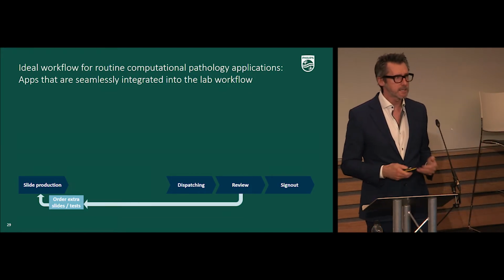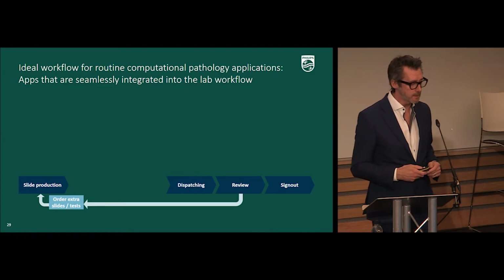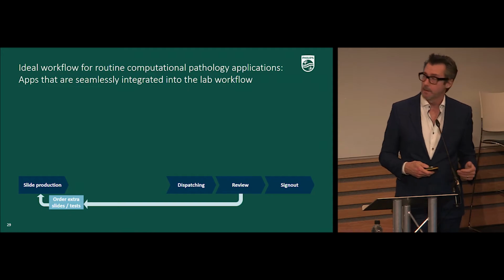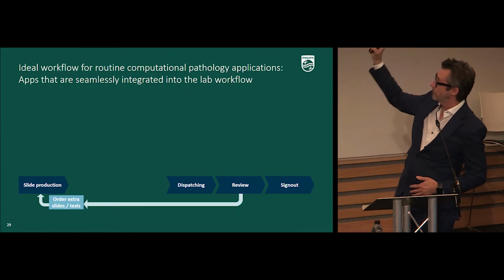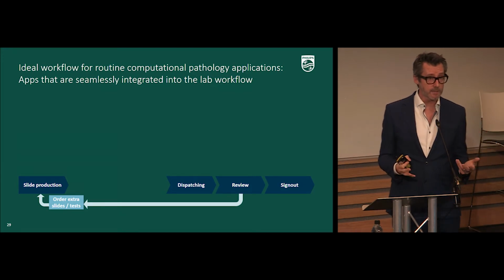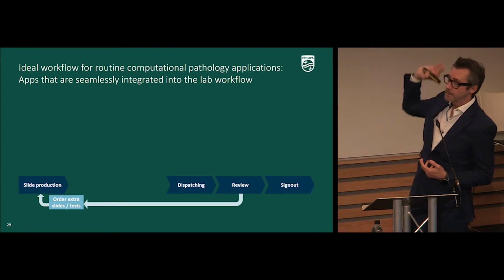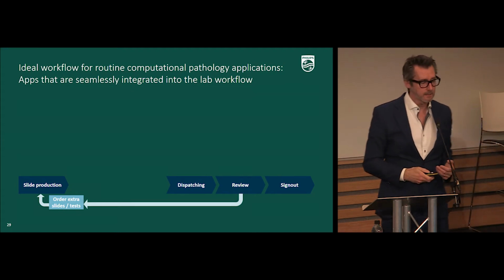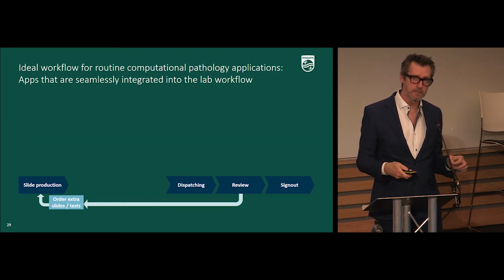This you will recognize as a typical workflow within a clinical pathology, diagnostic pathology laboratory, where you have slide production at one end, they're dispatched to pathologists, the pathologists will review them, they may decide to order extra tests or slides, and then they will make a decision and sign that case out. That workflow is being transformed today.